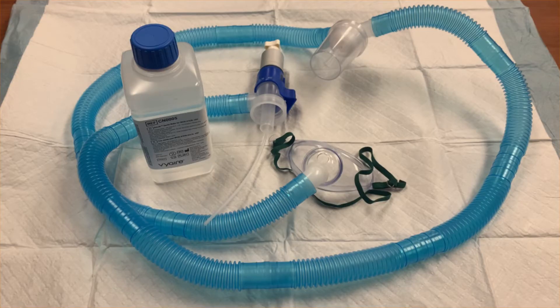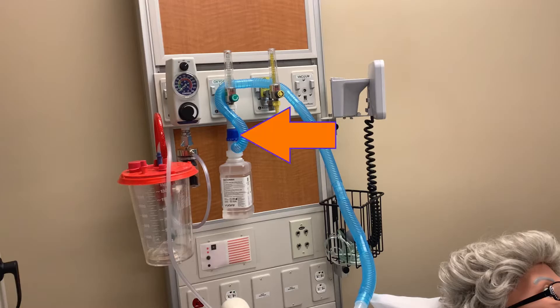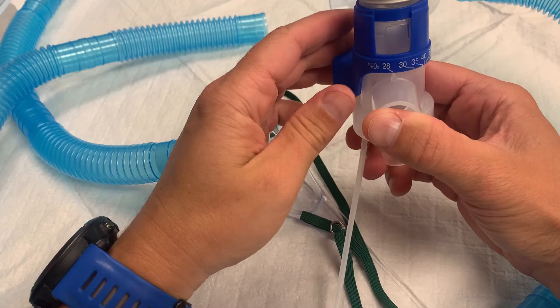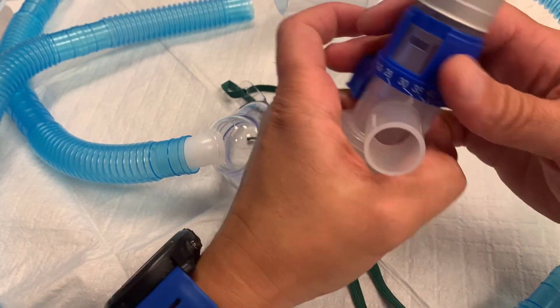Let's begin by looking at the tracheostomy setup. The general supplies include a venturi setup attached to the wall oxygen unit, which connects via a hose to a collar that sits over the patient's tracheostomy. Attached to the wall oxygen unit will be a venturi setup attached to a sterile water bottle. This device controls the amount of oxygen delivered to the patient, functioning like a venturi mask. Room air is mixed with the oxygen from the wall unit, and you can control oxygen delivery by rotating the blue collar around the base of this unit.